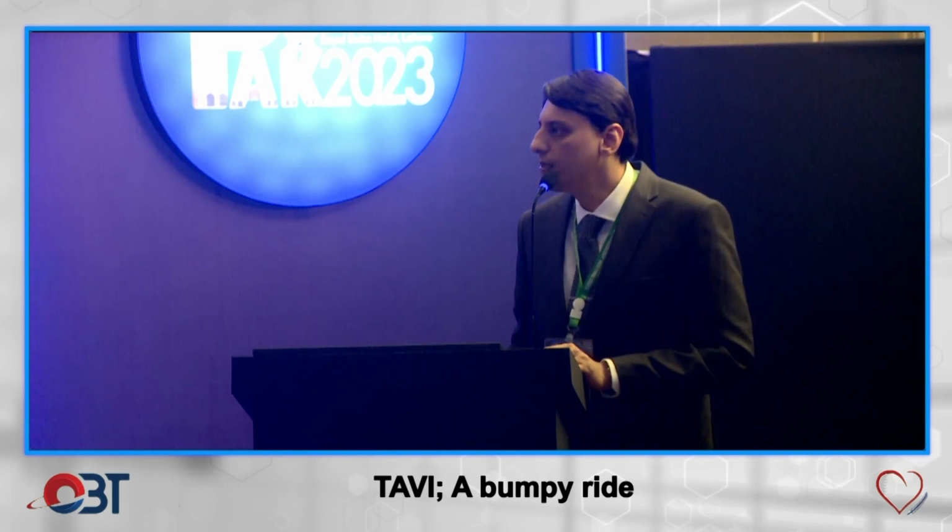Thank you. So I would request Dr. Ali to elaborate that. Before Ali, because I think the questions will also be answered by Ali. A very good case, Dr. Qasim, but did you calculate the calcium score of the aortic valve on the CT scan? No, we didn't, and it's now relatively obsolete to calculate the CT calcium score. We already knew that the patient had a severe symptomatic AS. We could use the CT calcium score in helping a diagnosis of AS, but now it's obsolete to use it.